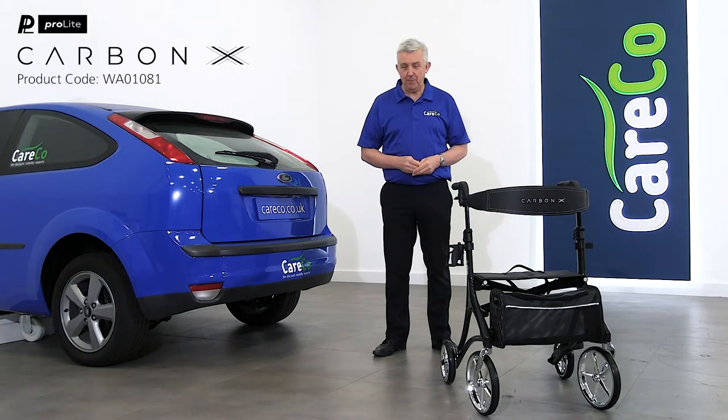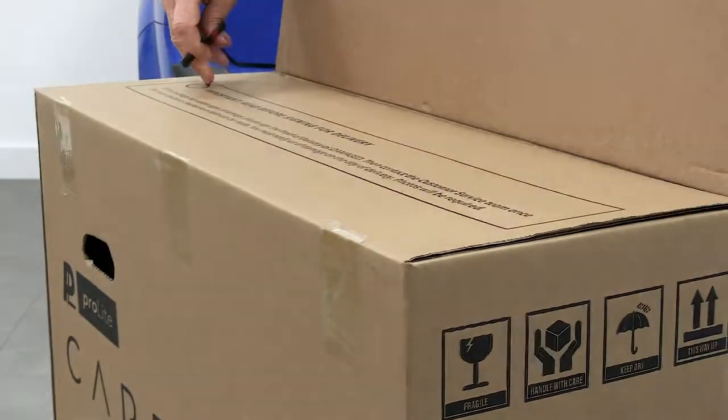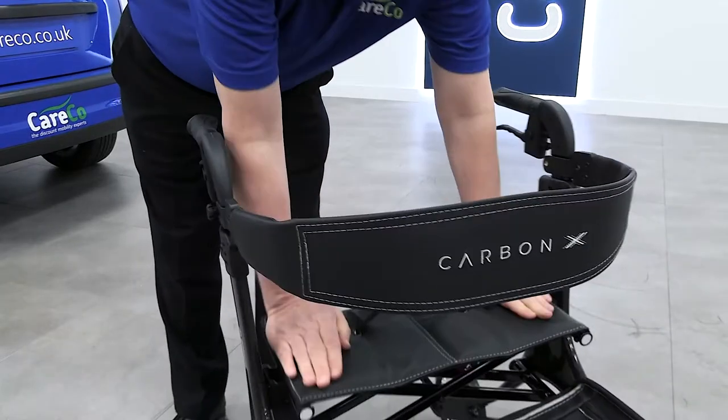This is the ProLite Carbon X. Our super light carbon fiber rollator has been expertly engineered for graceful gliding. Lighter and stronger than standard aluminium models, this revolutionary carbon fiber rollator will have you positively gliding.